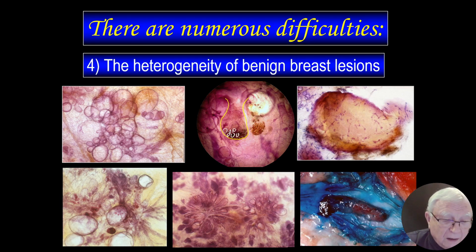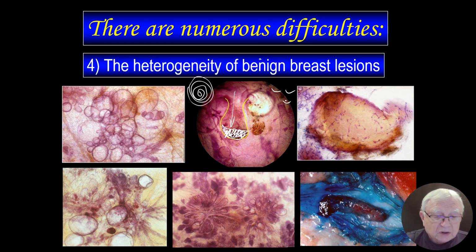And these are like onion rings, laminated calcifications. That's sediment here. On the mammogram, we are going to see this, the whole thing, not the details, just this, as teacup, tea saucer-like calcifications.